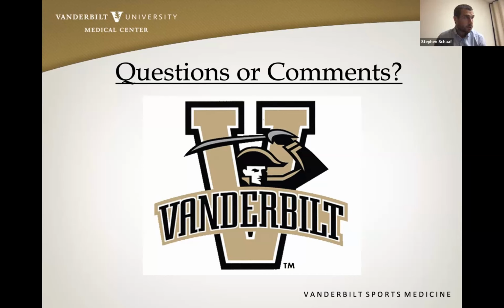I even asked plastic hand surgery and radiology, and in discussion, I will say they didn't use contrast. And so a lot of the time, when you're using these, they're going to be recommending that, just to see if there's any extravasation. But obviously, the one downside is the MRI sequences are very small as you're going through those. And this is a very small ligament. So a lot of the time, if it just passes over, for whatever reason, with the sequence that they're taking, I think that these can easily be missed on conventional MRI.